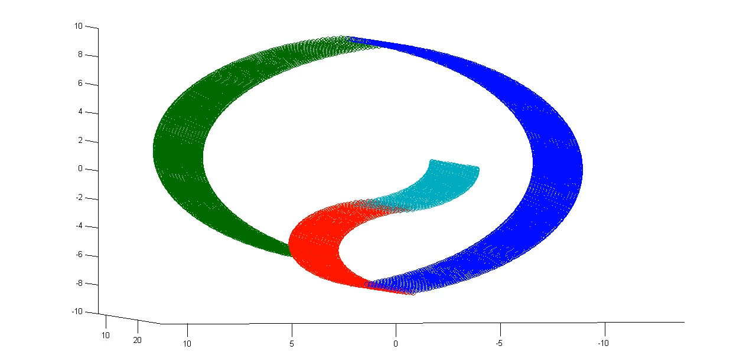And so that basically constitutes the simplest way of analyzing fMRI data. To do the more abstract things, like when will learning happen, usually requires that you have some sort of model of what you think is going on internally that has latent variables. You can say, well, in my model, this value changes this way over time as the person does this task. I could look for a signal that changes that way in the brain as well. And then I could say, oh, maybe the brain is implementing this model that I have of learning or of some other cognitive procedure.